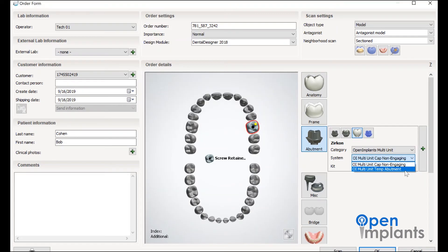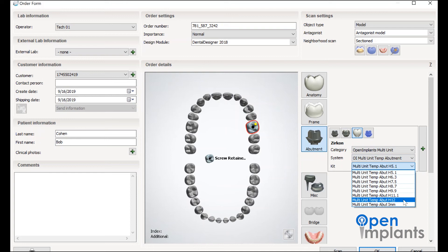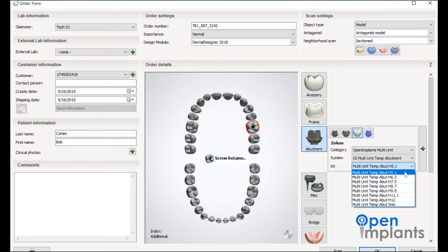Now let's move on to the multi-unit selection. This option is for non-engaging implant caps, compatible with the Nobel multi-unit titanium inserts, attached to the heights up to 12 millimeters.